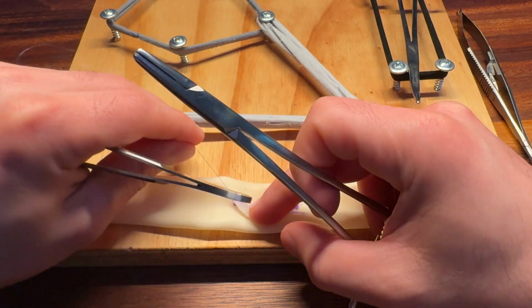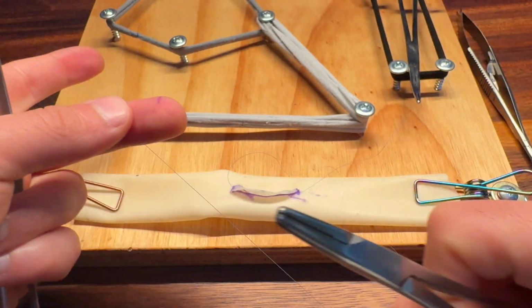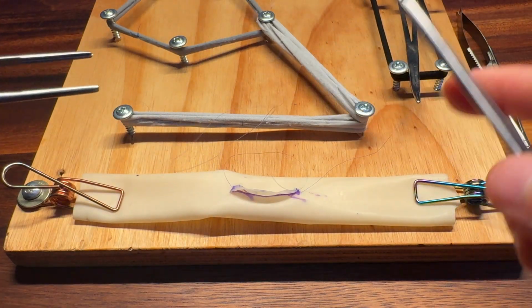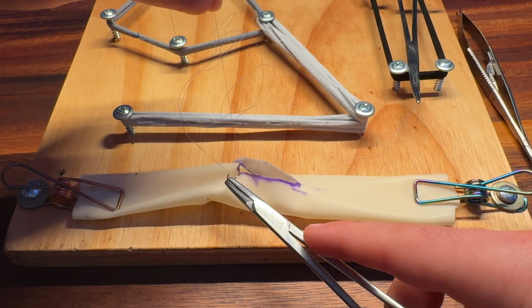This is where the anastomosis gets a little bit tricky, because now I'm somewhat close to the apex. So this next throw here is going to be a backhanded throw, right? So I'm going to reverse my needle and load it backhanded. I'm going to use some gentle traction here, and I'm going to go right at the apex, right?